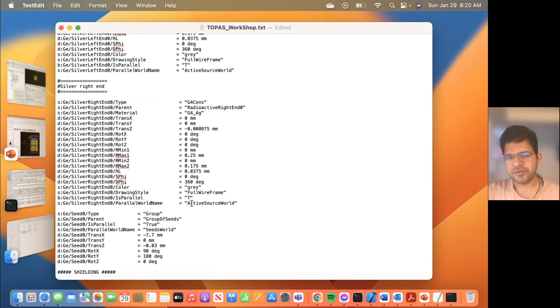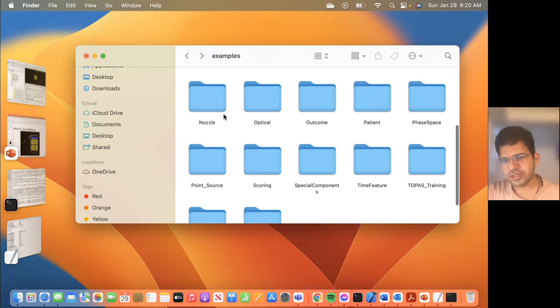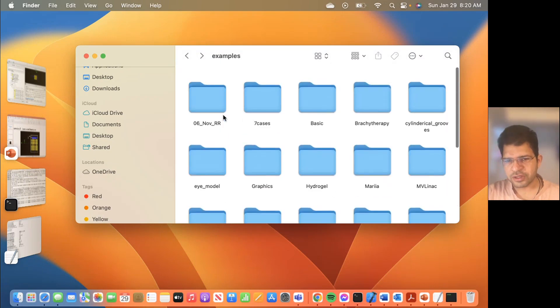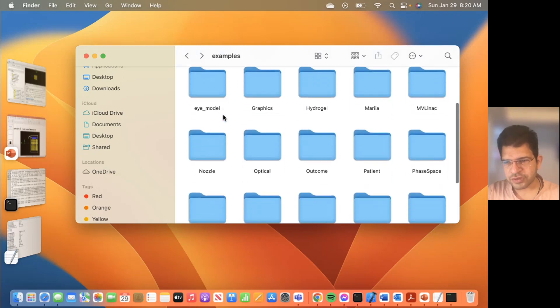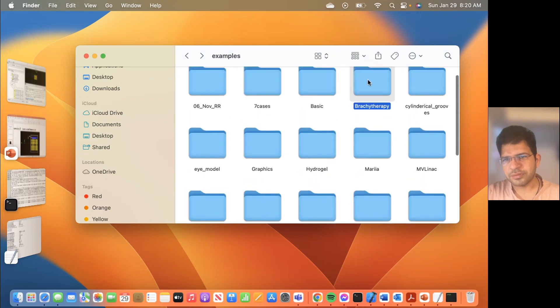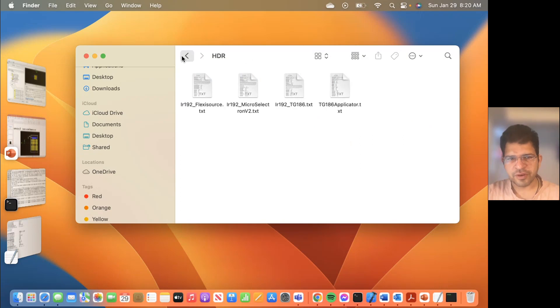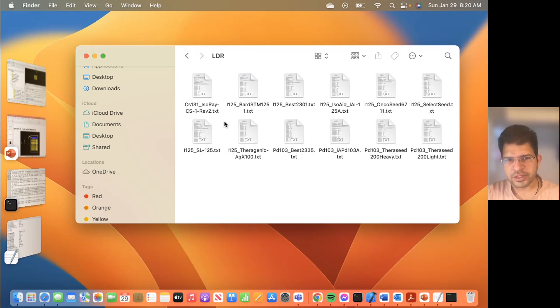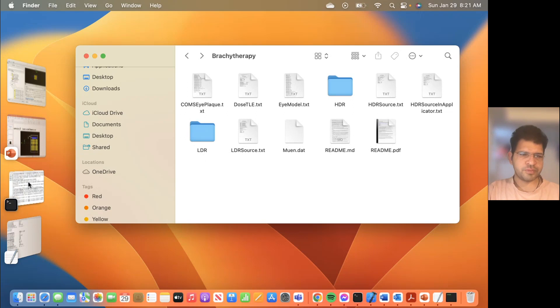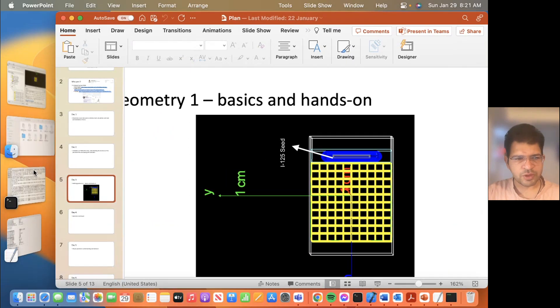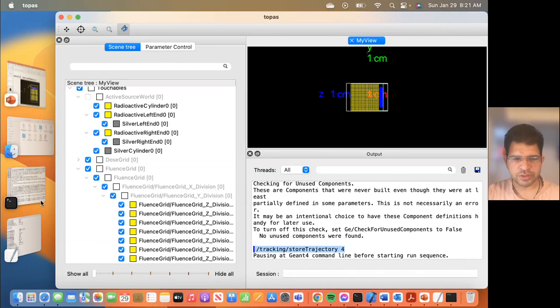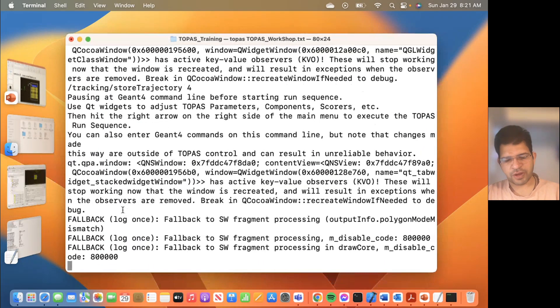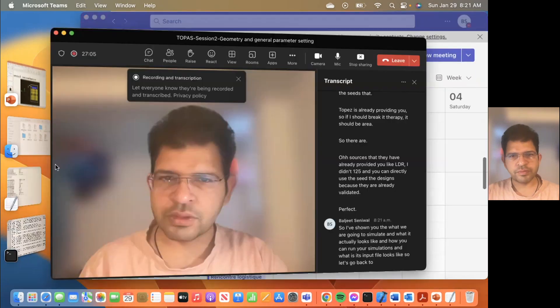Here is the input file. You see here I have defined the active seed and it has several components. There is a radioactive cylinder that is placed inside. And then there is a left end and the right end in the form of sphere or cone. And then there is another radioactive cylinder placed inside which contains the radioactivity. So it is not just made from single component. It has a series of components joined together to design a seed. In future, if you'll be doing brachytherapy, you will need this, how to define your source. And for your initial beginning, there are examples of the seeds that TOPAS is already providing you. There are sources that they have already provided like LDR iodine-125, and you can directly use the seed designs because they are already validated. So I have shown you what we are going to simulate and what it actually looks like and how you can run your simulations and what the input file looks like.